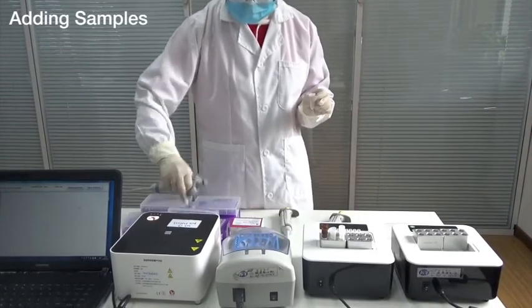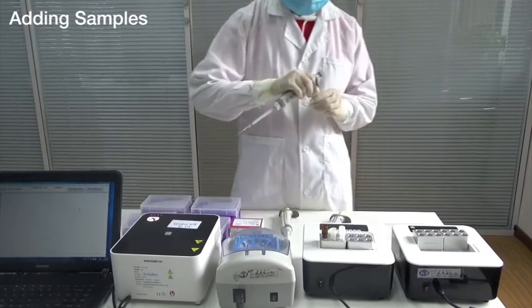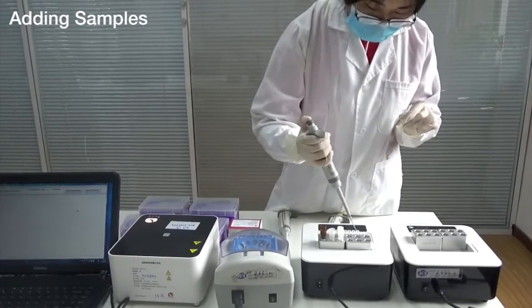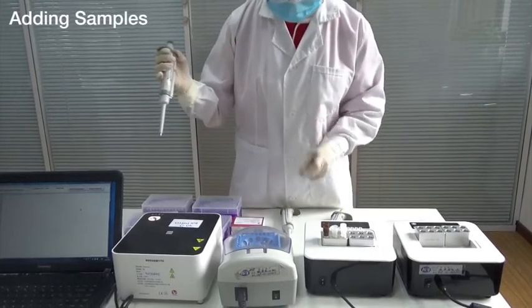Third steps: adding samples. Separately add 5 microliter samples from step 2, one positive control and one negative control, into two different reaction tubes.